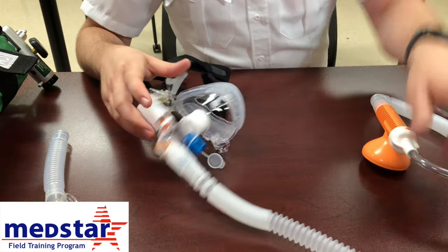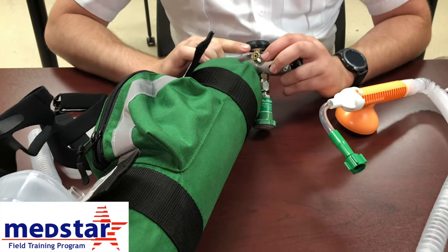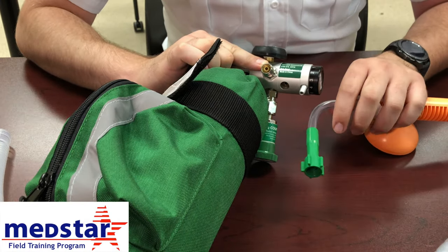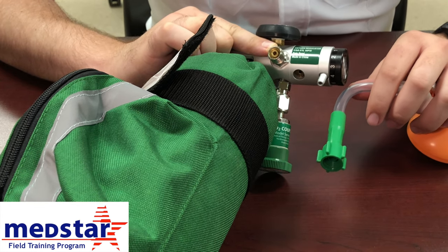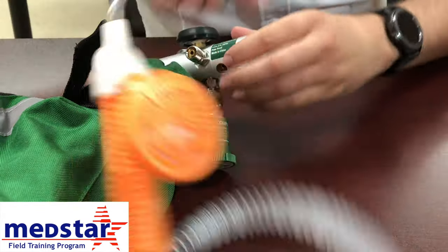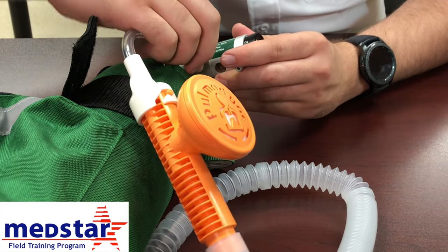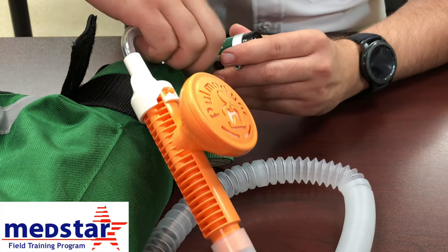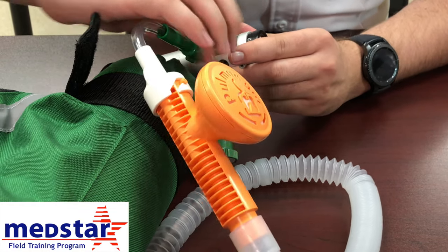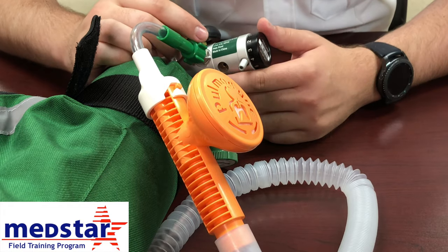To connect your CPAP to oxygen, you'll need the green screw end. Take the end with the green piece and screw it onto the high-pressure valve. Be careful — the green piece is plastic, and you can easily ruin the threads on the metal connection, so make sure it goes on straight. It should screw on quite easily, and once you do, it will automatically start administering oxygen. It does get quite loud, so it can become difficult to communicate with your patient over the noise of the CPAP.